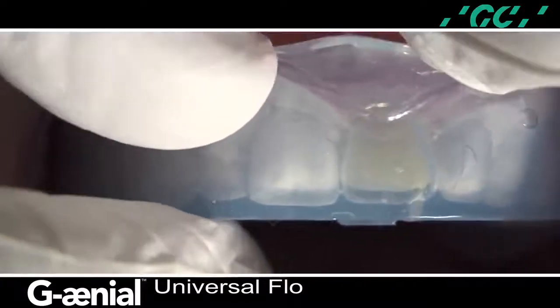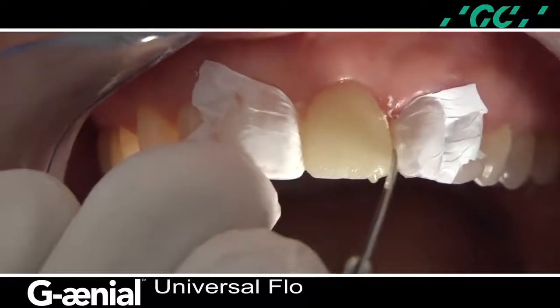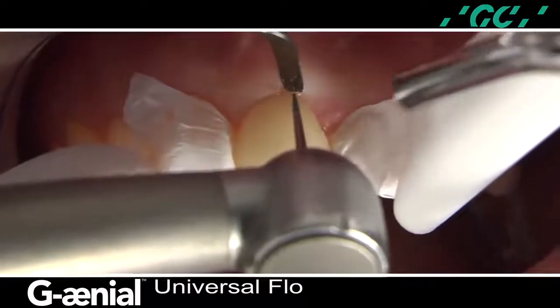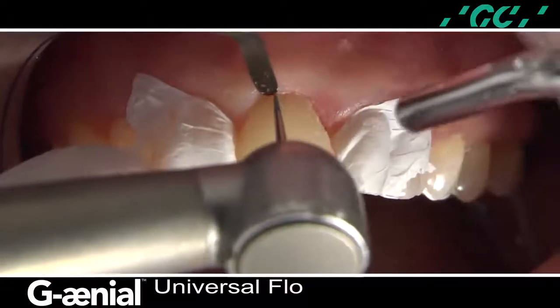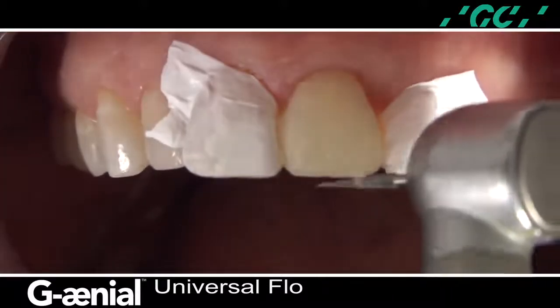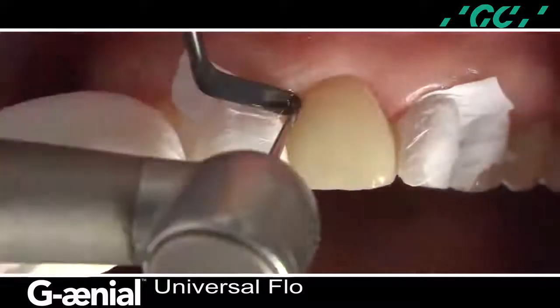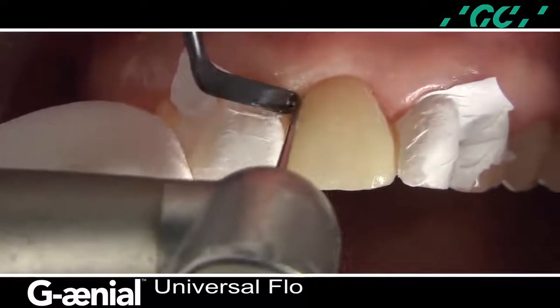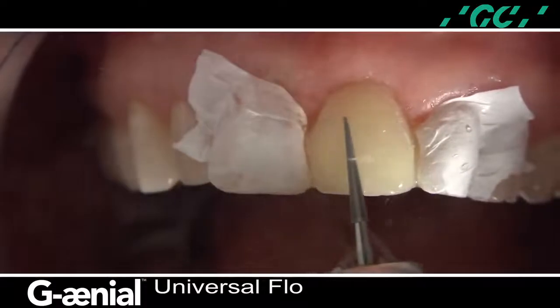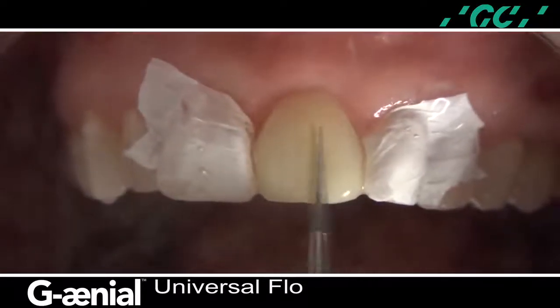The silicone matrix is removed and the excess polymerized composite resin was removed with a scalpel blade, a number 12 BD Bard Parker. The gingival areas are contoured and finished with a 30-micron tapered finishing bur, a DET-3 by Brassler, retracting the gingival tissue with an 8A instrument by Euphredi. The composite projection is removed and the incisal edge is contoured with an 8-fluted needle-shaped finishing bur, an ET-9 by Brassler. Gingival tissue is reflected with an 8A instrument to prevent tissue laceration while developing the emergence profile. An ET-9 by Brassler is used to finish the facial composite surface and maintain the natural anatomic contour.